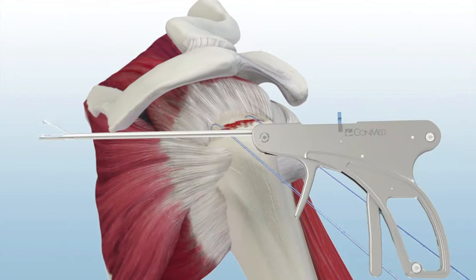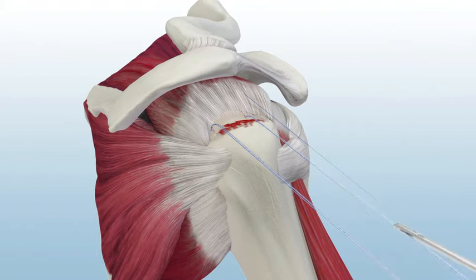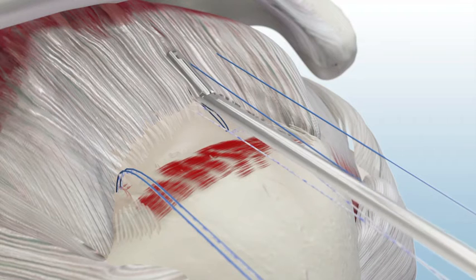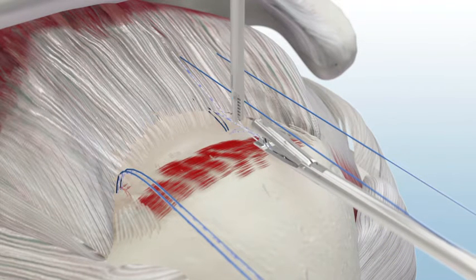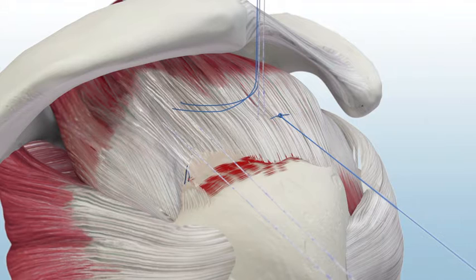The Spectrum AutoPass Suture Passer is used to pass 2 sets of mattress stitches from each anchor. AutoPass reliably passes suture in thick tissue and gives the surgeon the option of capturing the suture in the trap door or releasing the suture in the joint. Then, 1 set of mattress stitches from each anchor is tied using a sliding knot.